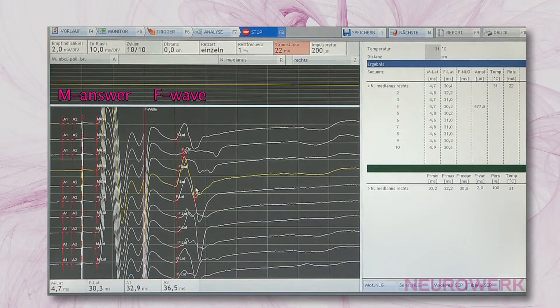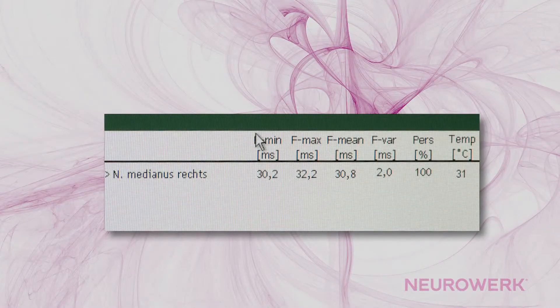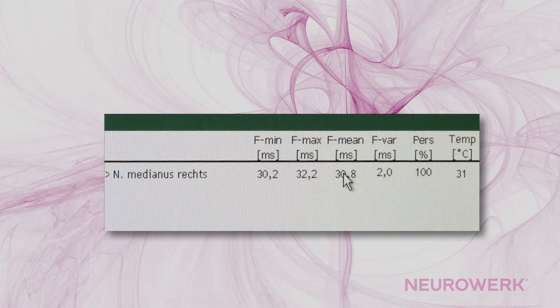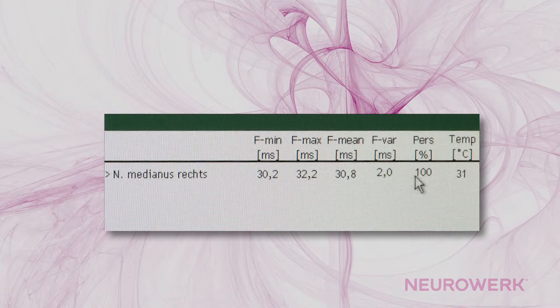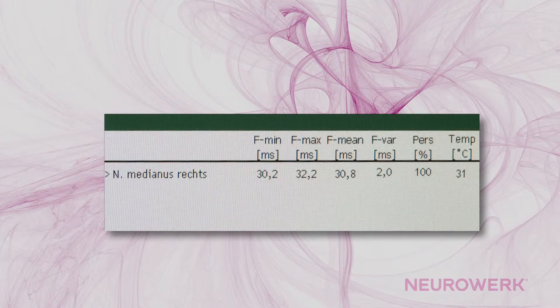In the results table, the shortest latency of F-Waves, the longest latency of F-Waves, the average of the latency of F-Waves, the variance of F-Waves, and the appearance — the so-called persistence of F-Waves — are displayed in percentage form.